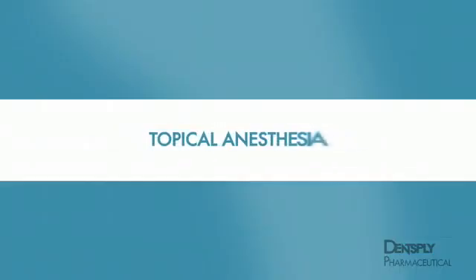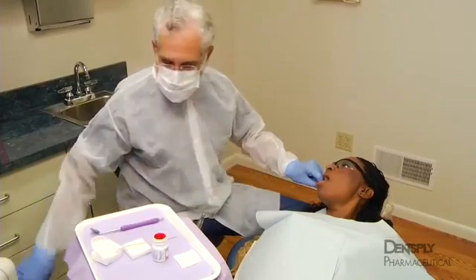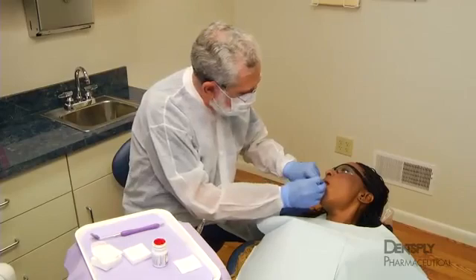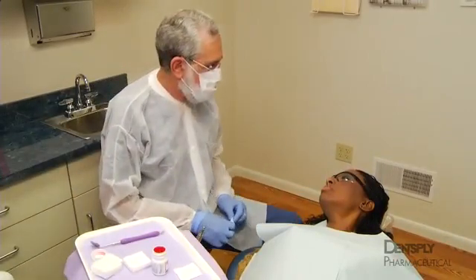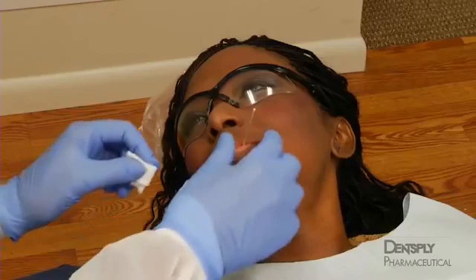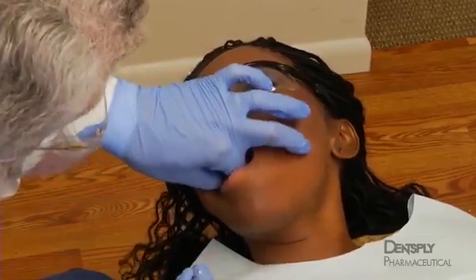Topical anesthesia. To desensitize the mucosa before needle insertion, a topical anesthetic is applied to the injection site. The mucosa is first dried with a sterile gauze, and a small amount of topical anesthetic is then painted on with a cotton-tipped applicator. After the topical agent has had time to take effect, it will result in mucosal anesthesia to a depth of 2 to 3 millimeters. Residual anesthetic and surface debris are removed with a sterile gauze immediately before injection.